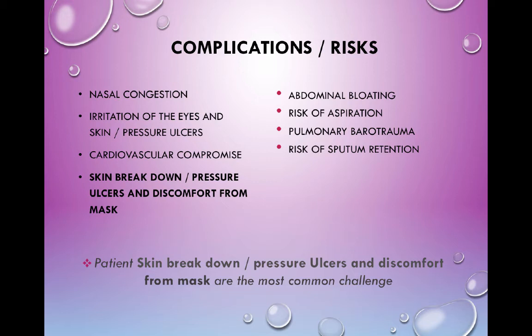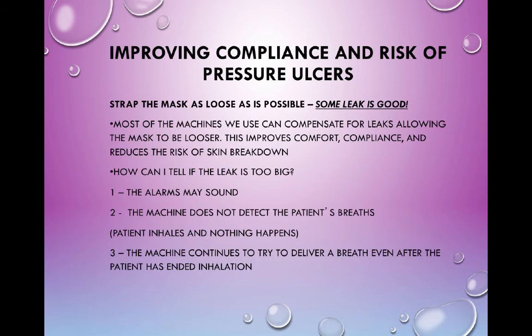I don't know. Pulmonary barotrauma. It's kind of rare to cause barotrauma with a BiPAP as well, but it's listed. And then abdominal bloating, that is kind of common. So now, two of the biggest problems I already said: skin breakdown, pressure ulcers, and compliance. They're our biggest issues. So when we do this, improving compliance is really about making the patient comfortable, and in turn that will also help with any kind of pressure ulcers. Our newer BiPAP machines, and unfortunately I couldn't bring one along because we have a very busy volume of BiPAP patients right now.